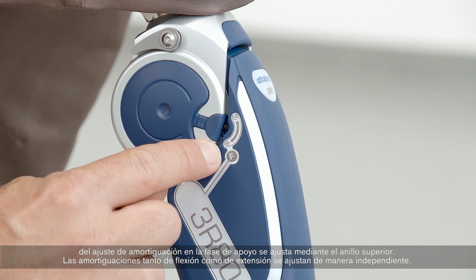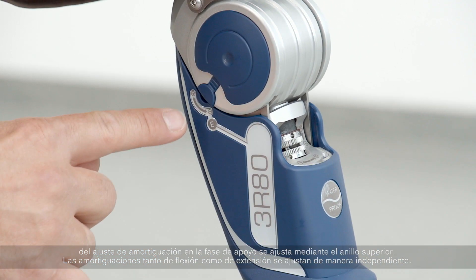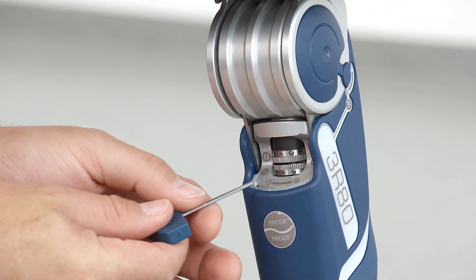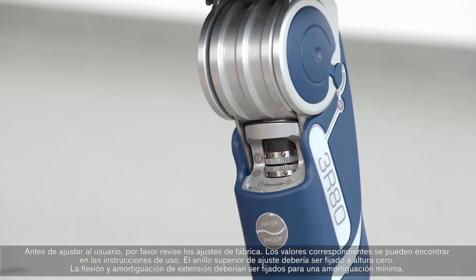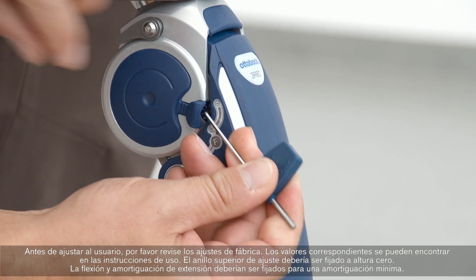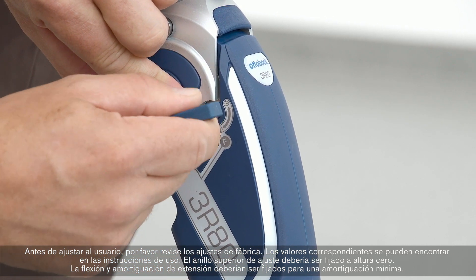Both flexion and extension damping are independently adjustable. Before fitting the user, please check the factory settings. The corresponding values can be found in the instructions for use. The upper adjustment ring should be set at zero clearance, and the flexion and extension damping should both be turned to minimum damping.